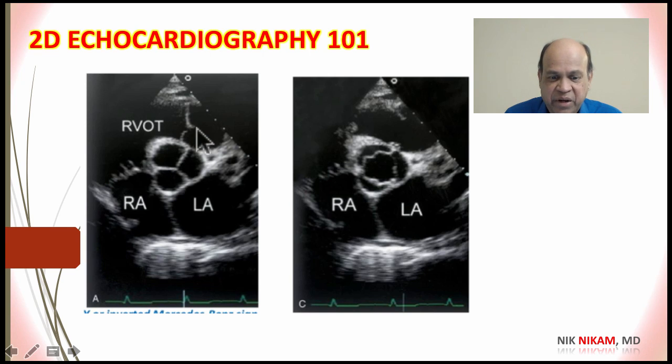Chances are we may not see the mitral, and we may never see the tricuspid leaflets and the pulmonic leaflets in most situations, but we are going to use this anatomic location to look for tricuspid regurgitation and pulmonic regurgitation and pulmonary artery pressure. And behind the aorta we have the left atrium. We can also measure the aortic size, the aortic valve opening, and the left atrial size in this view also.